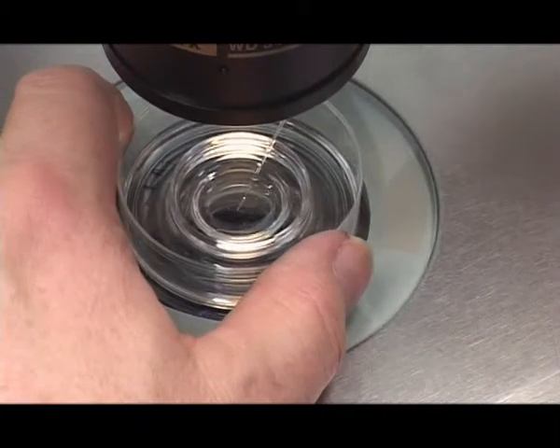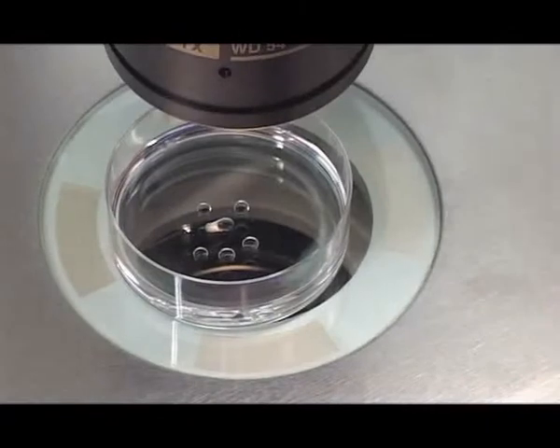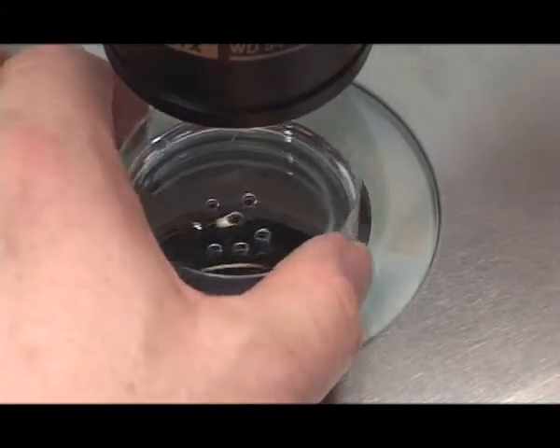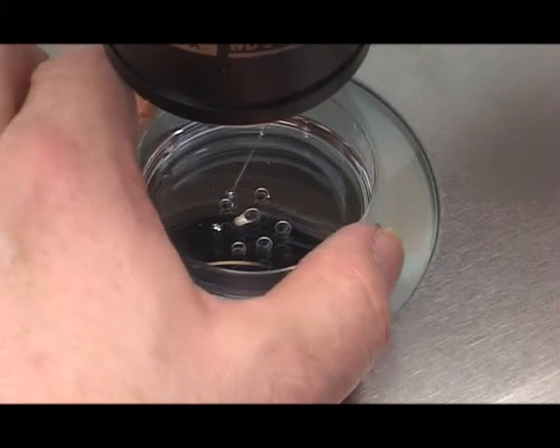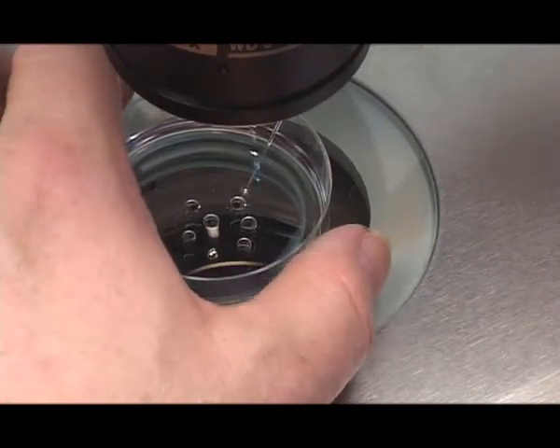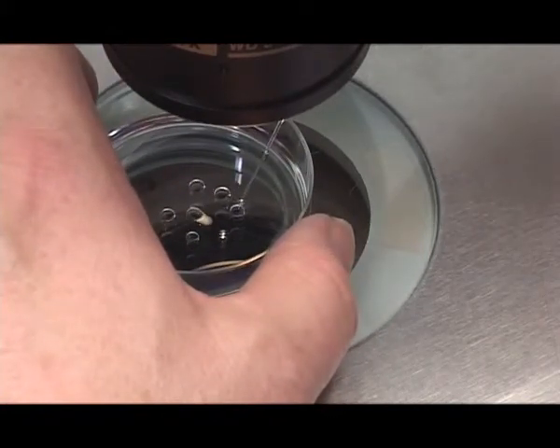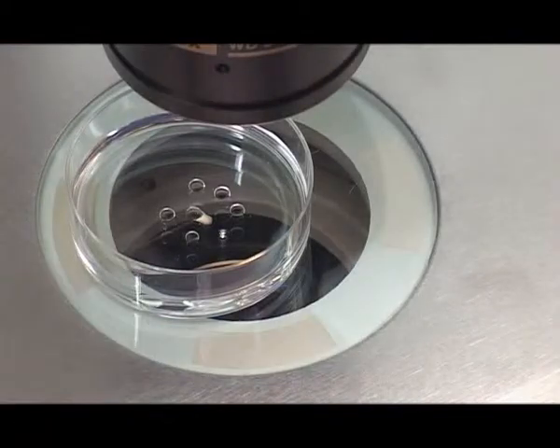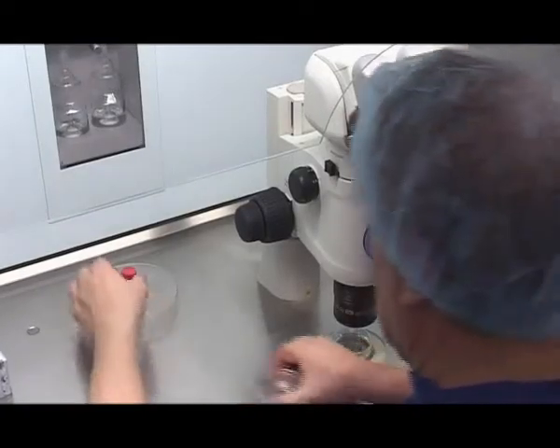After that, aspirate a suitable number of oocytes. Place one oocyte in each holding media drop. Incubate the remaining oocytes.